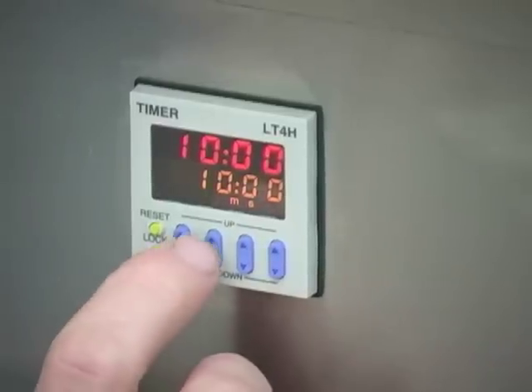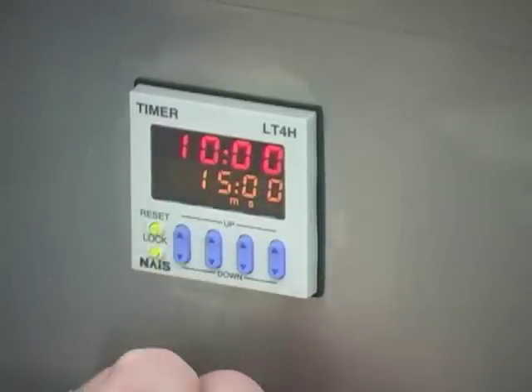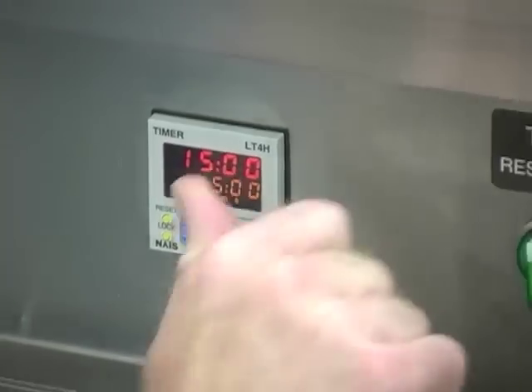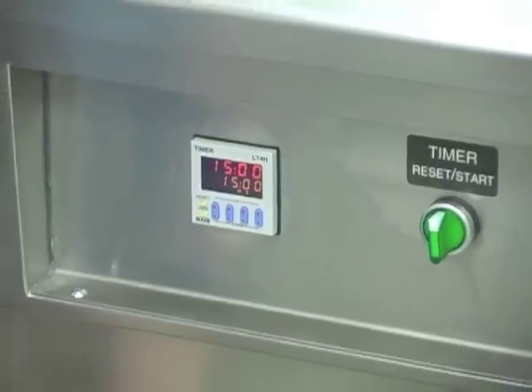So we're going to adjust from 10 minutes to 15. Once you get it set where you need it, switch it over to timer reset and you'll see your timer reset.